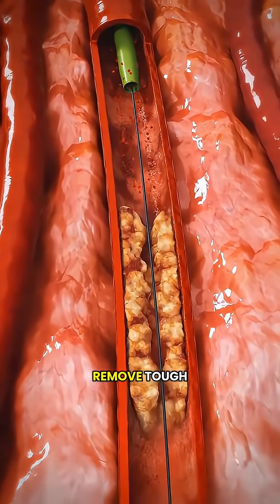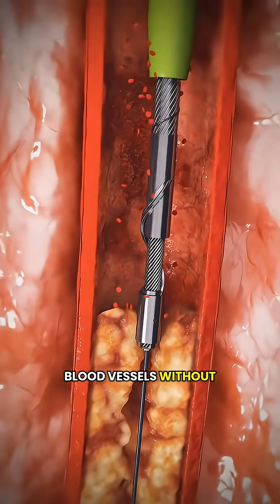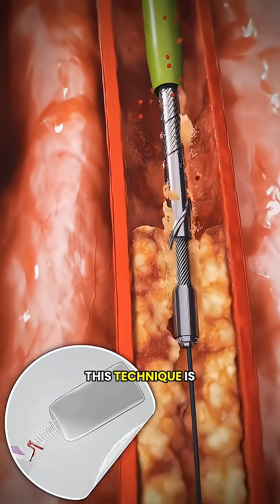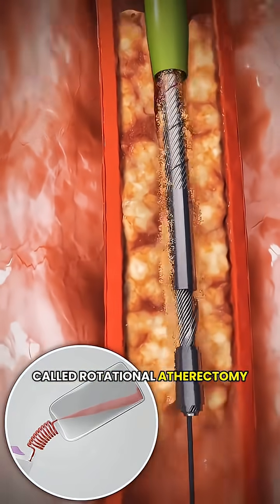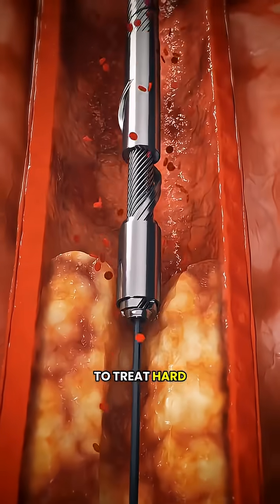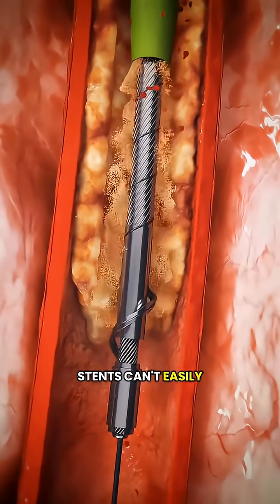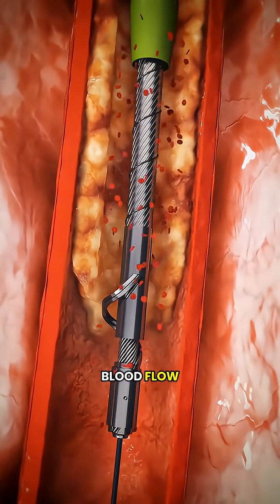Have you ever wondered how doctors remove tough, calcified blockages inside blood vessels without making a big incision? This technique is called rotational atherectomy. It's a minimally invasive procedure used to treat hard, calcified blockages that regular balloons or stents can't easily open, helping restore proper blood flow.